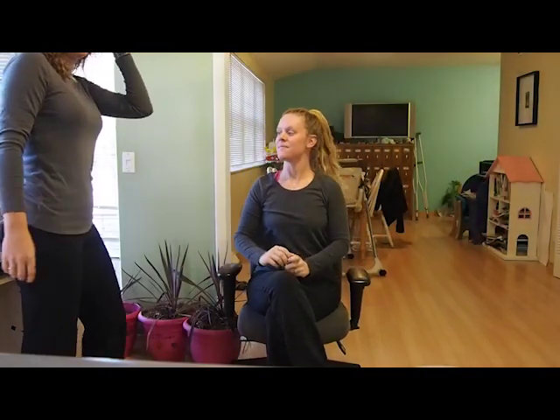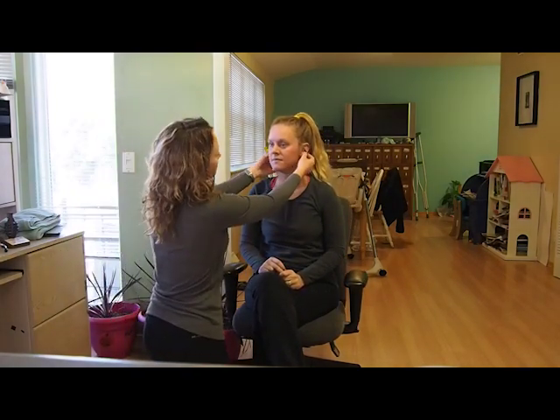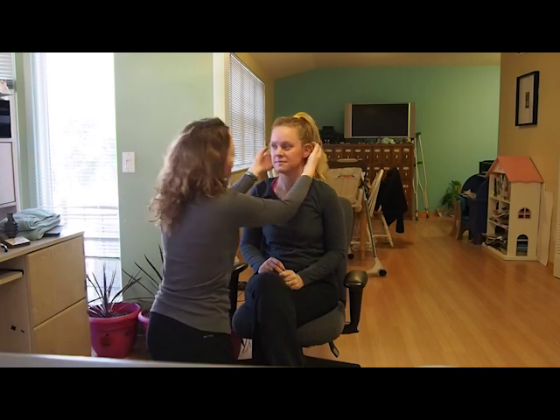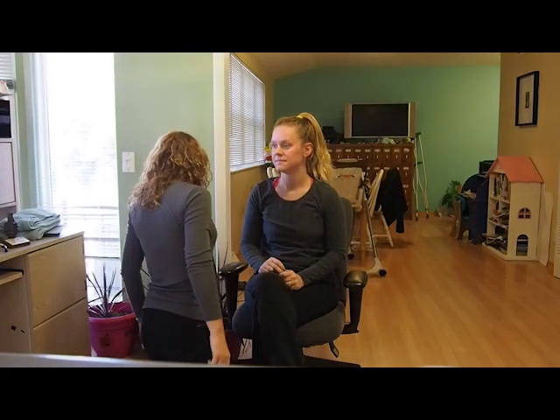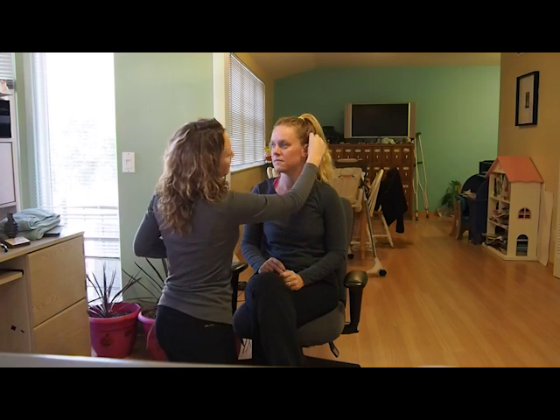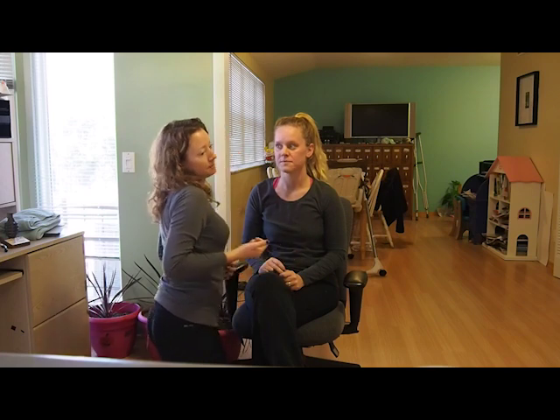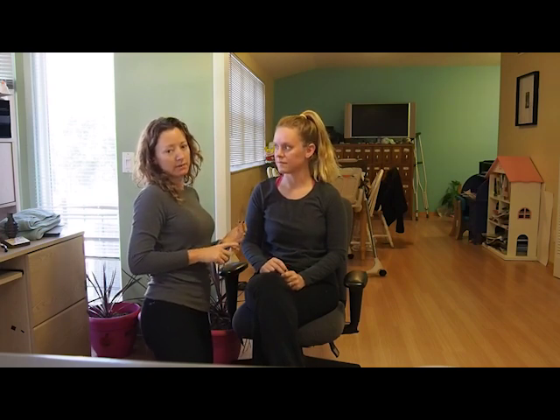Okay, next I'm assessing her ears. So first again, inspecting, making sure they're symmetrical, looking at the outsides, looking behind to see if there's any issues with skin or pain, asking about any pain or sensation issues. Then as far as looking at the external ear, those would be the things you would look for. Internally, I would use an otoscope to assess the inner ear, making sure that there's not too much wax that could be affecting hearing.